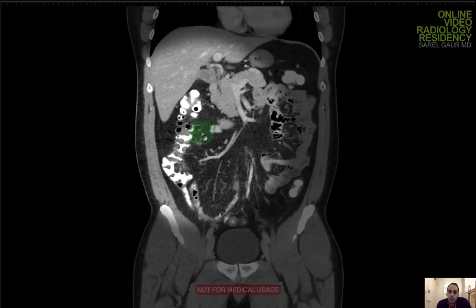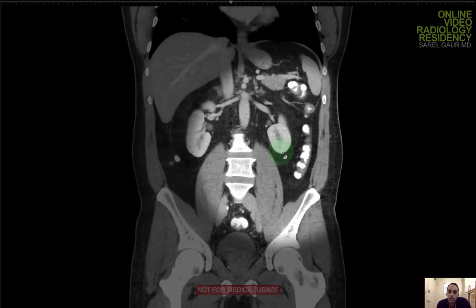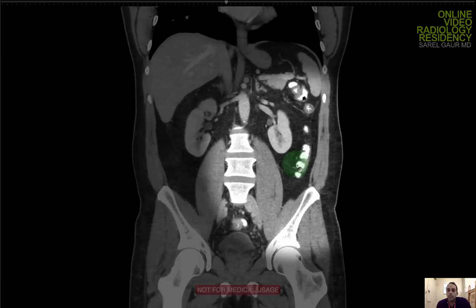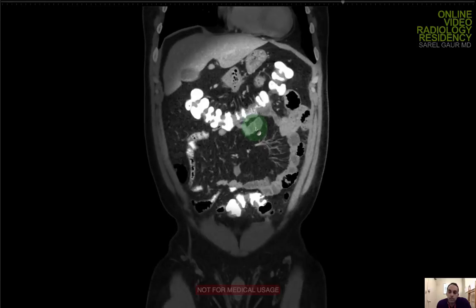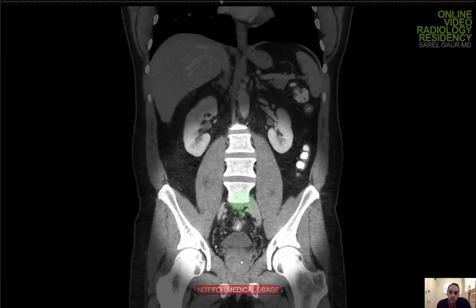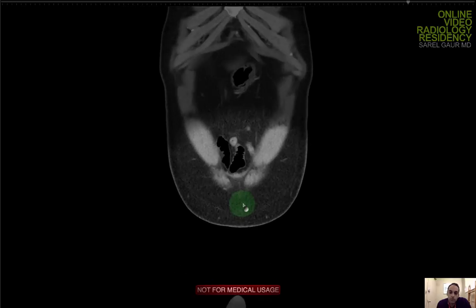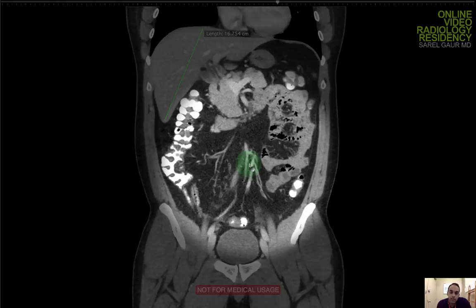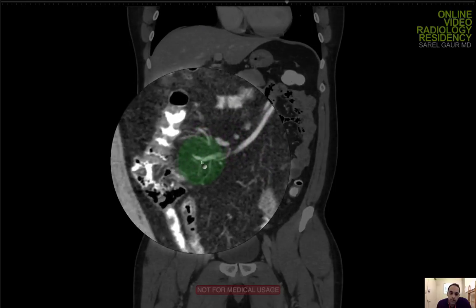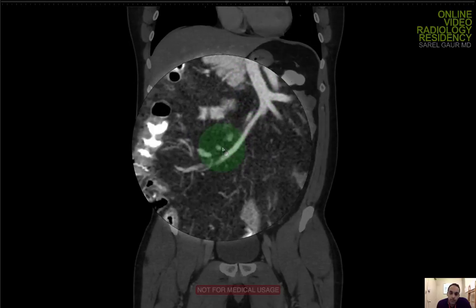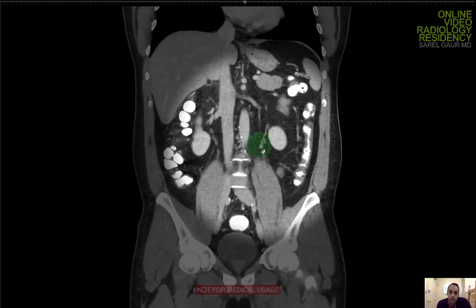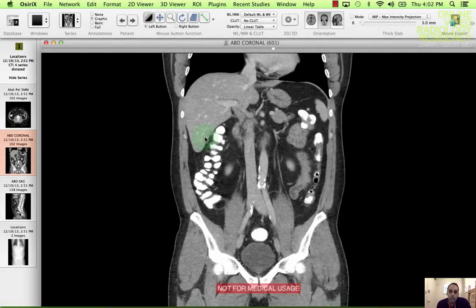Now I'm going to look at the small bowel in the coronal plane. Starting with the jejunum — looking for any wall thickening, any dilatation like a small bowel obstruction, and inflammation of the mesentery. Not seeing any of those things. Focusing down on the ileum — looking for the same: thickening, obstructed loops, inflammation in the mesentery, or nodes. I'm seeing just a couple of regular-sized lymph nodes along the mesentery near the superior mesenteric vein. Everything looks okay.